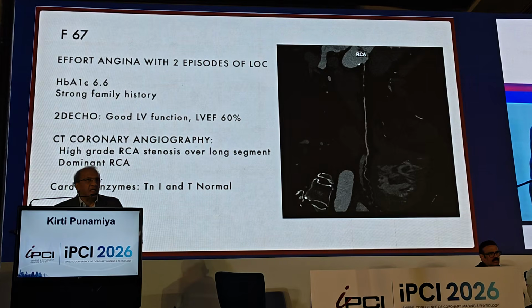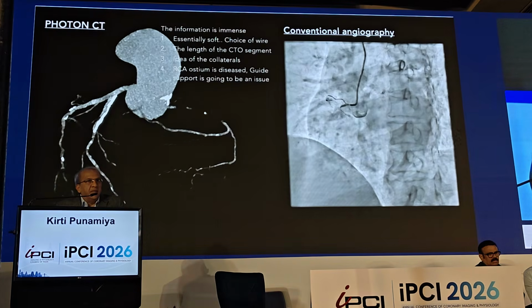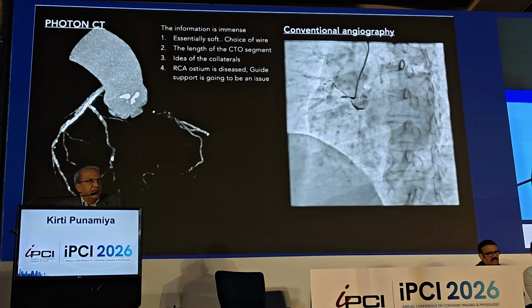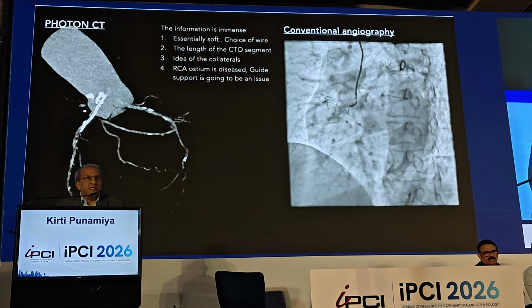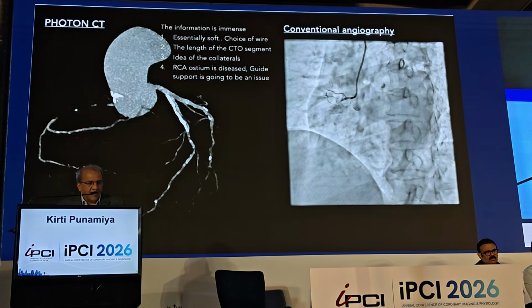And as we advance, I'll take you a little deeper into this. So having said that, this is a VRT, and this VRT can be rotated in any three-dimensional axis to get the right concept.